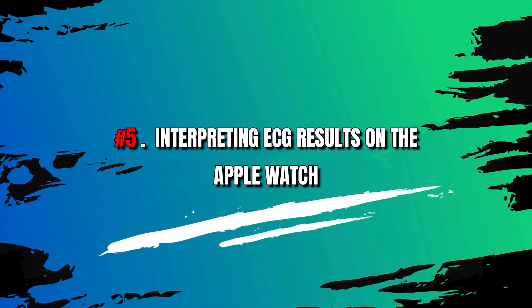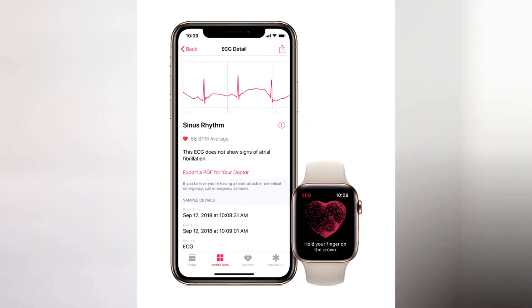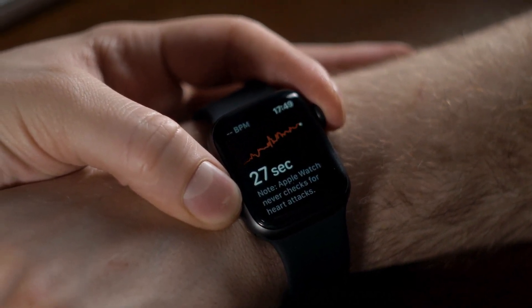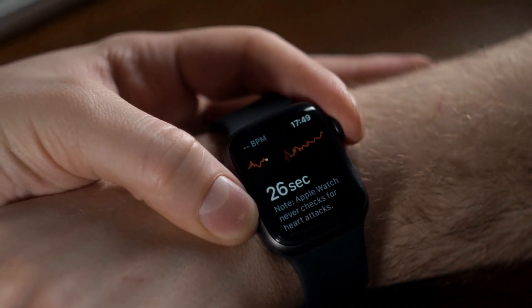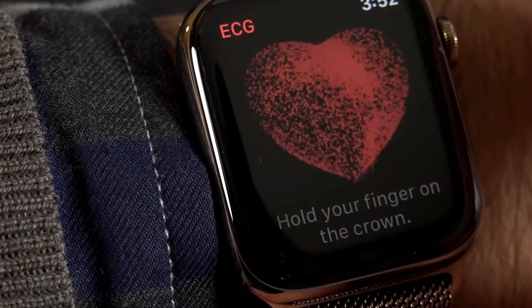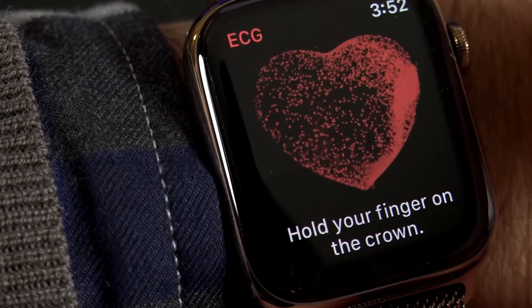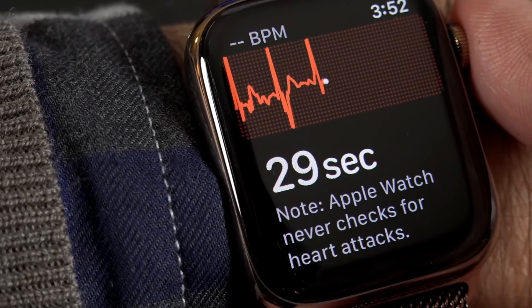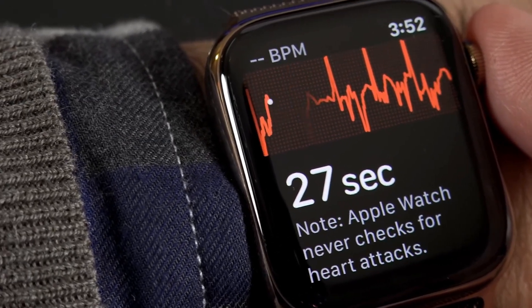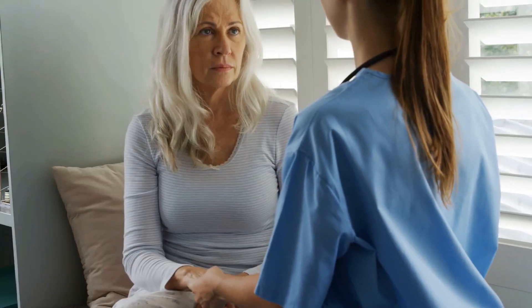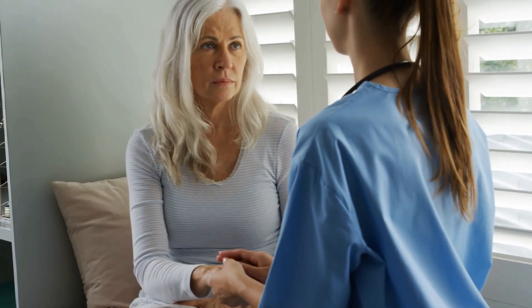Number 5: Perform an ECG on your Apple Watch following the instructions from our previous tutorial. Once the reading is done, view the results on your watch screen, focusing on the waveform that shows your heart's electrical activity. Check for any irregularities — the ECG app can detect atrial fibrillation and send notifications for irregular heart rhythms. If you observe irregularities or have concerns, consult a healthcare professional for evaluation and interpretation.